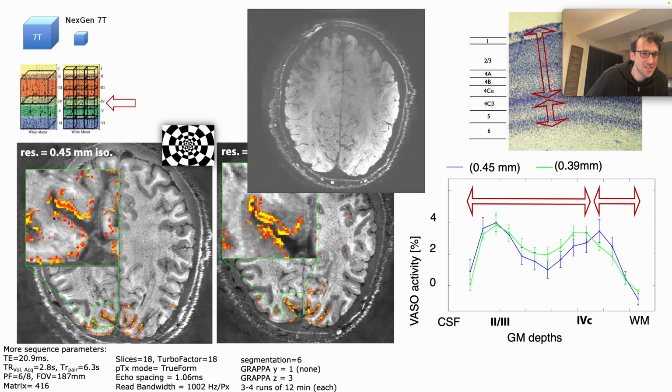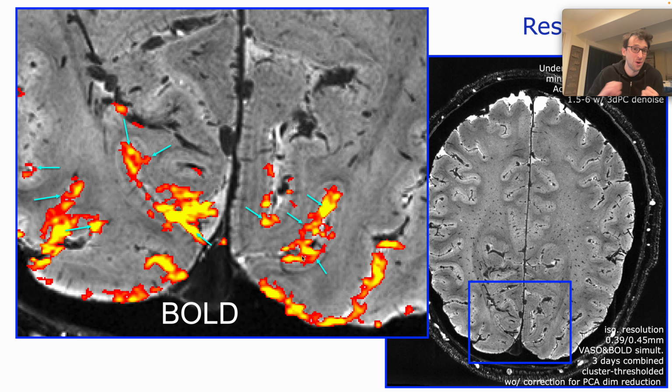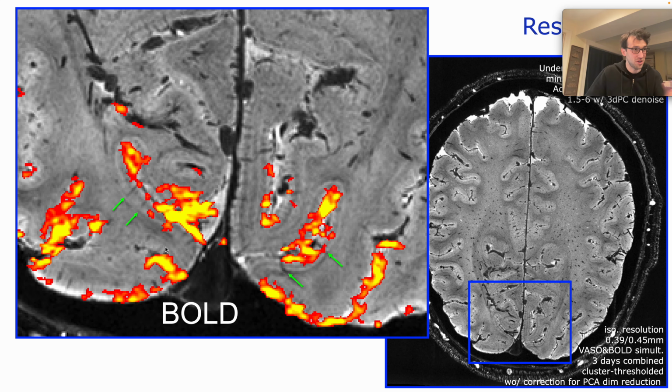For example, here that's just barely visible, we could see enough structure, for example, with respect to the angioarchitecture that you see in these multi-echo GRE data as these diving veins, in addition to these very deep layer 4 here. And at those diving veins, we, as expected, saw a lot of BOLD signal changes from these oxygenation changes, but at this resolution, it's not so simple that the vein is always a problem. Namely, some of those veins actually did not show a huge BOLD bias. So the within-voxel and the cross-voxel dephasing is different, obviously, across resolutions.